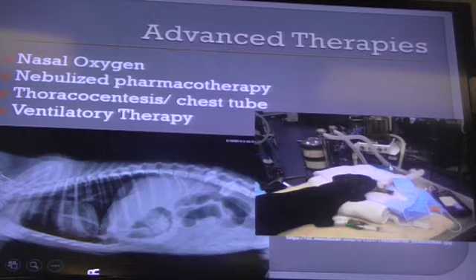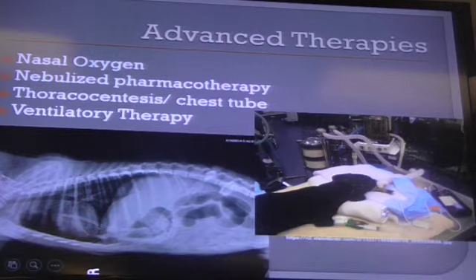We can't keep them on 100% oxygen forever. 100% oxygen is toxic after about 24 hours. So we have to balance the amount of oxygen and room air these patients are getting. They're getting just enough oxygen that it's not toxic to the cells in the airway, and enough additional air so that we're actually filling their lungs. If we can buy them time and let the lungs heal on their own, then we can discontinue the anesthesia. You see this guy's got a propofol drip going, in order to get that patient off the ventilator.